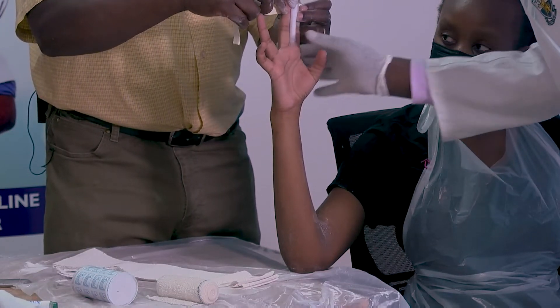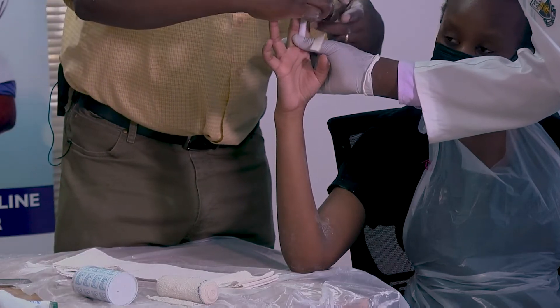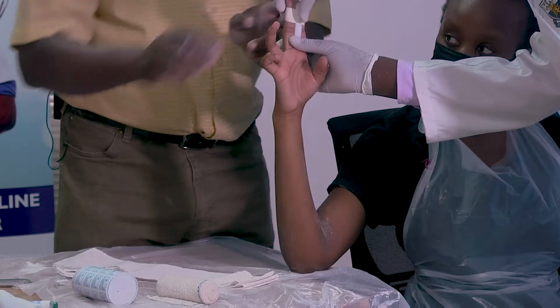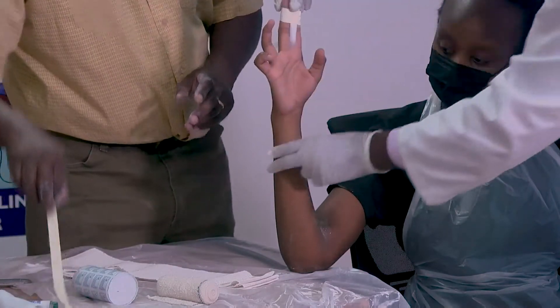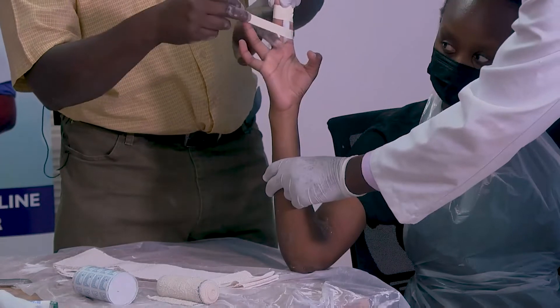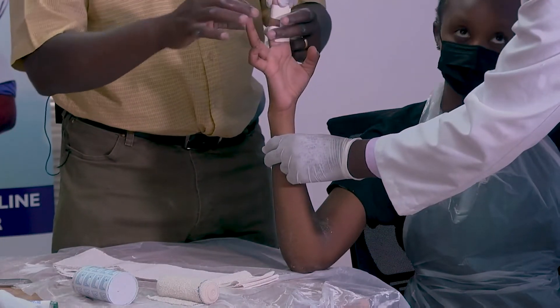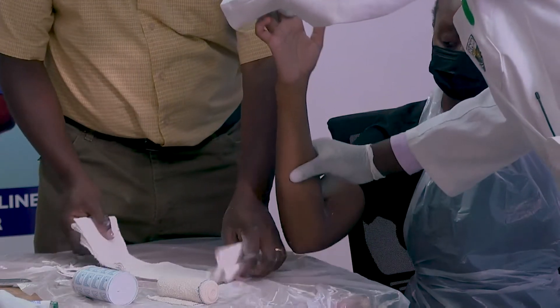For the distal part, ensuring it is not too tight and not too loose. Then I will take this one too — the proximal part. We are taping it. Splinting two fingers is very important because both of them add to the stability.